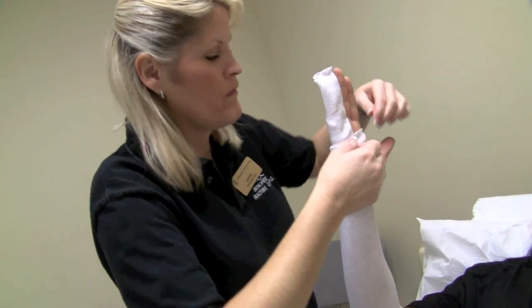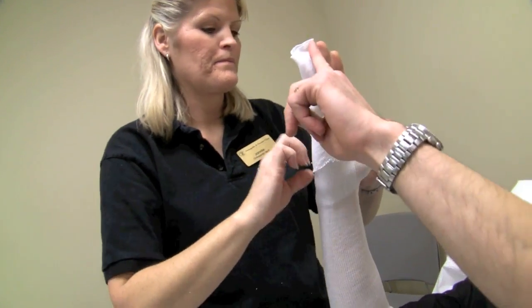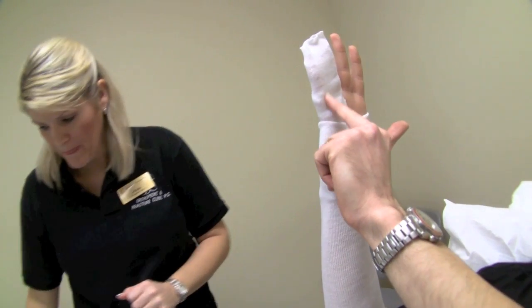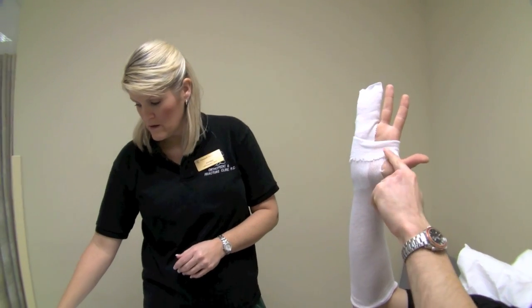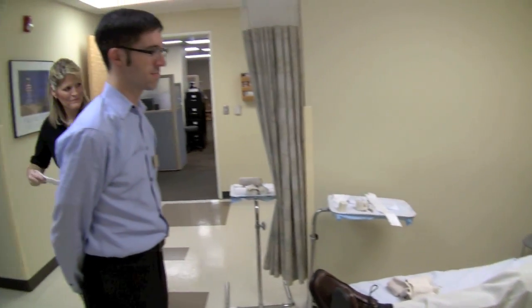The hand is now covered with a nice sock. We've got the part going for the ulnar gutter splint's distal element, the little sock over the pinky, and the part that covers the arm with a nice thumb hole. Hand surgeon Mac Beal is going to join us for putting on the ulnar gutter splint.